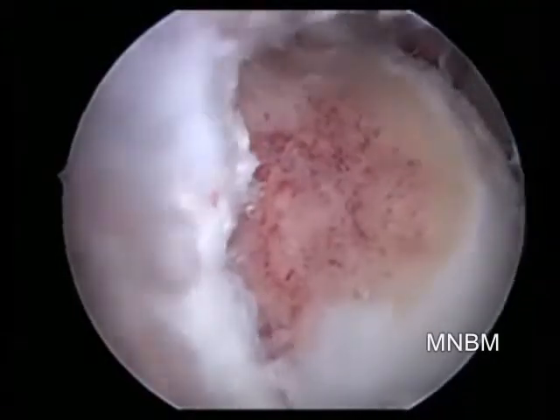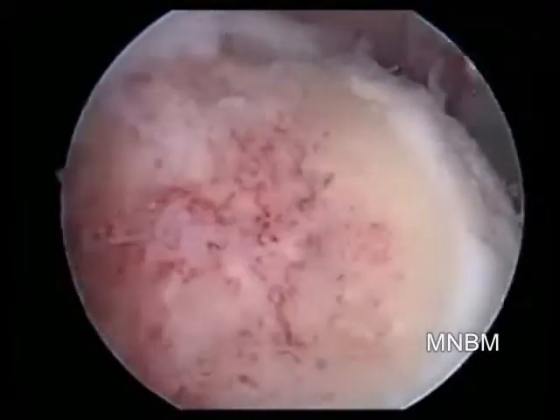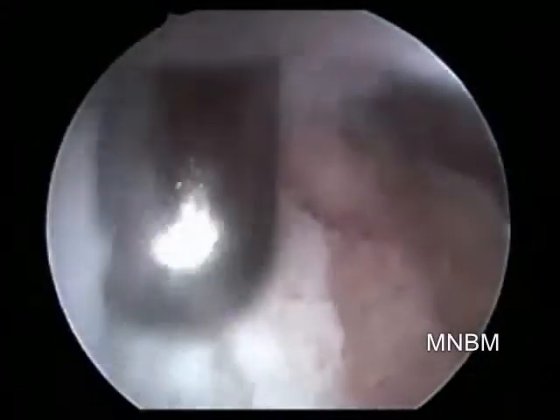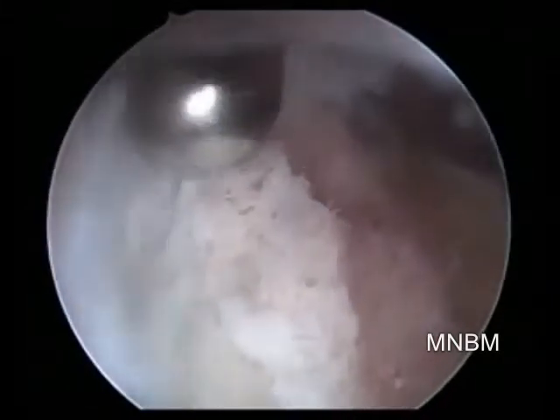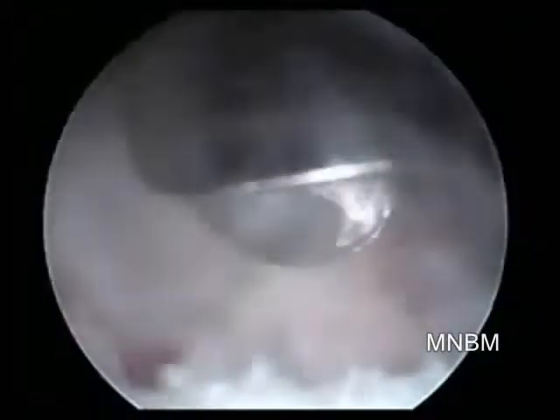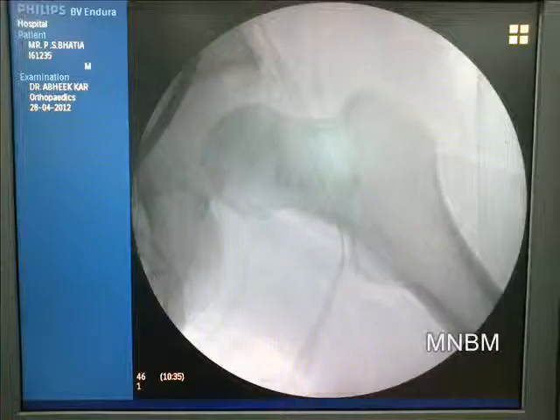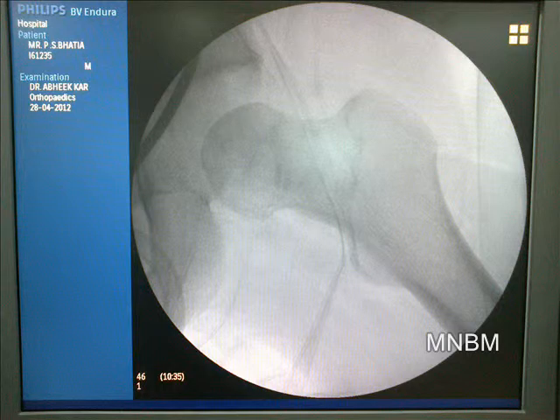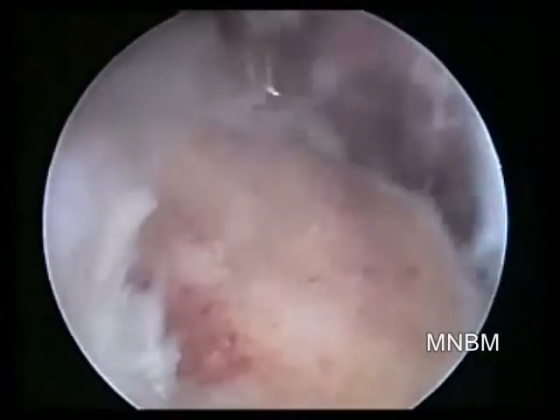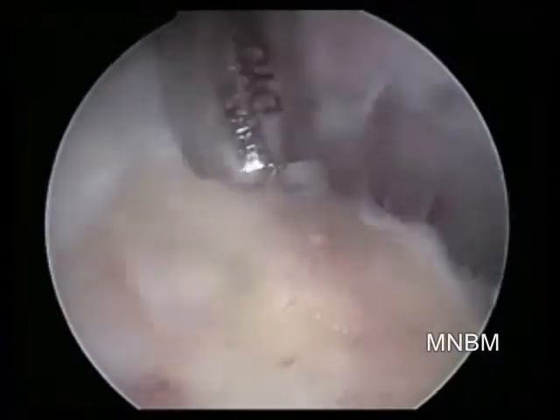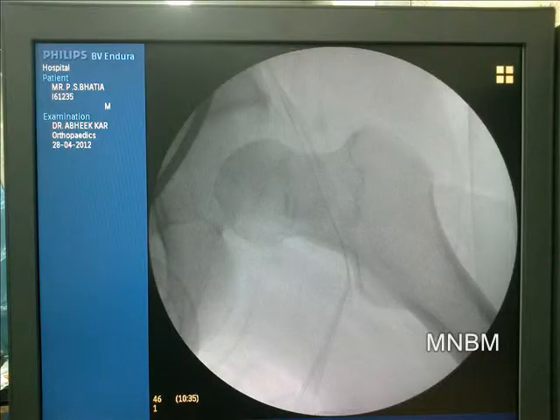Next, portals are changed so that we start looking from the anteromedial portal while the instrument comes in from the anterolateral portal. The rest of the osteophytes and protruding parts of bone are removed, leaving behind a smooth, rounded tennis ball-shaped femoral head. At every step, the joint is viewed under C-arm fluoroscopic control to confirm adequate reshaping of the acetabular margin and femoral head for smooth gliding. This does leave significant areas of raw bone, which cover up with fibrocartilaginous tissue over time.